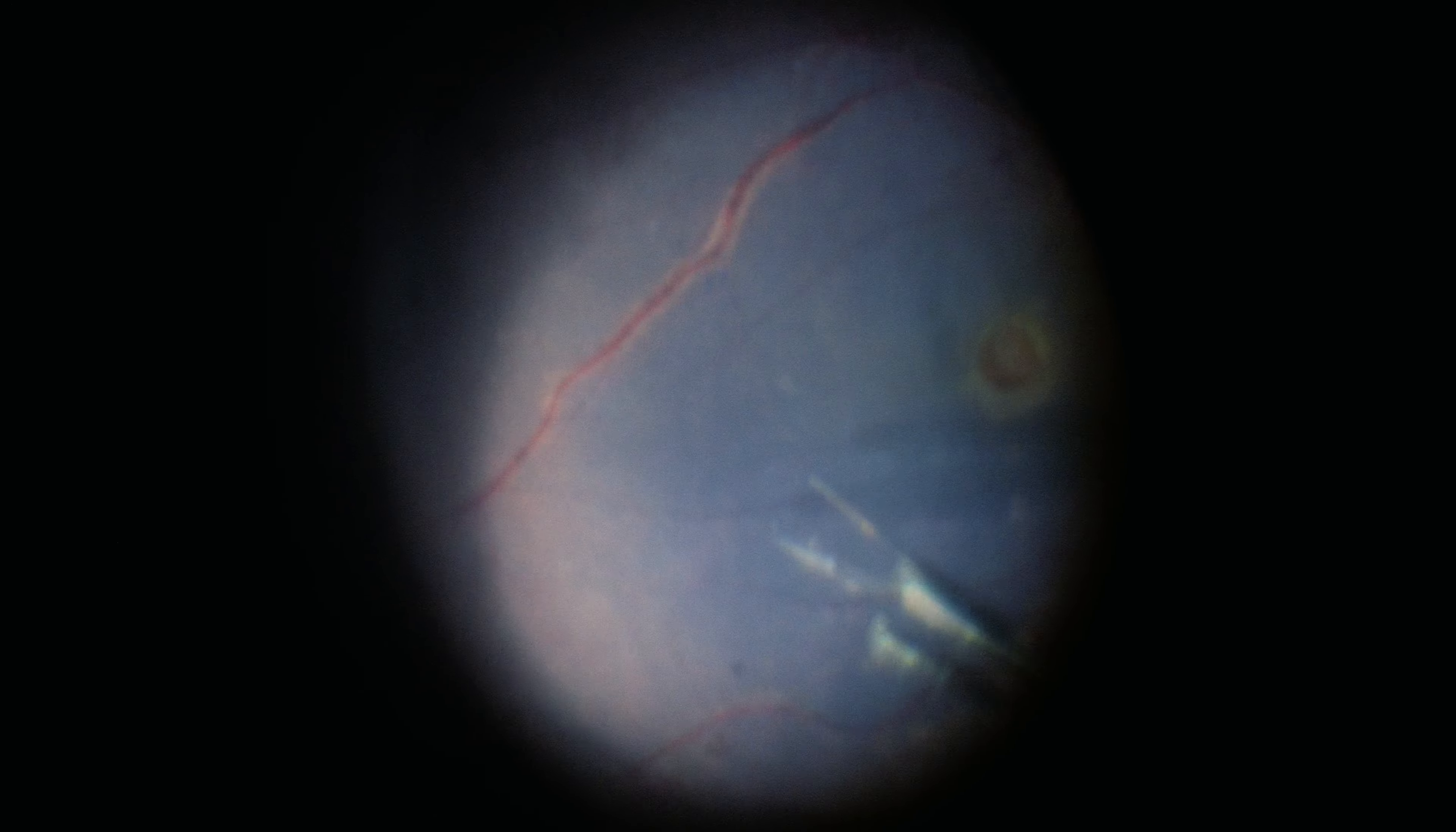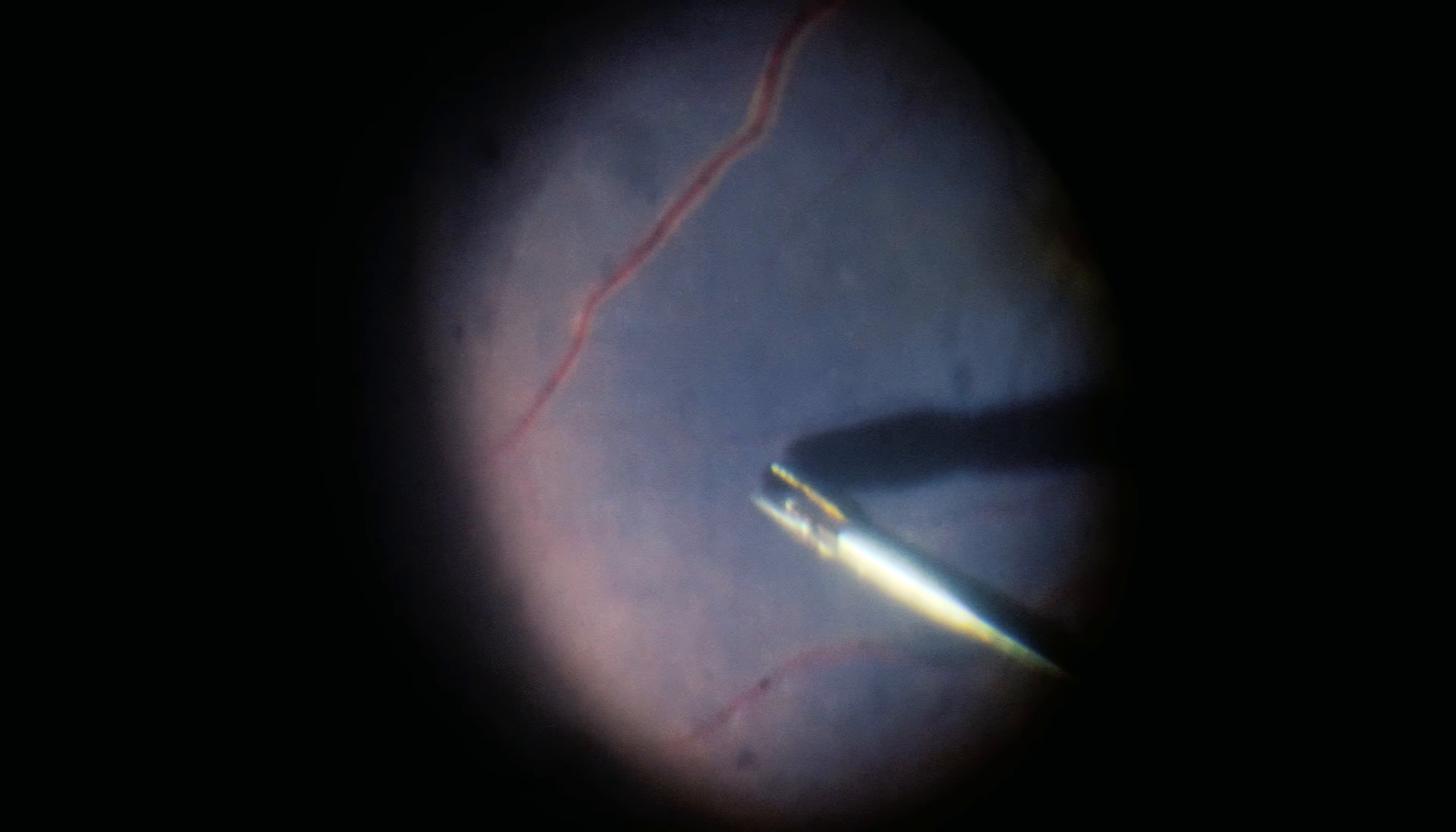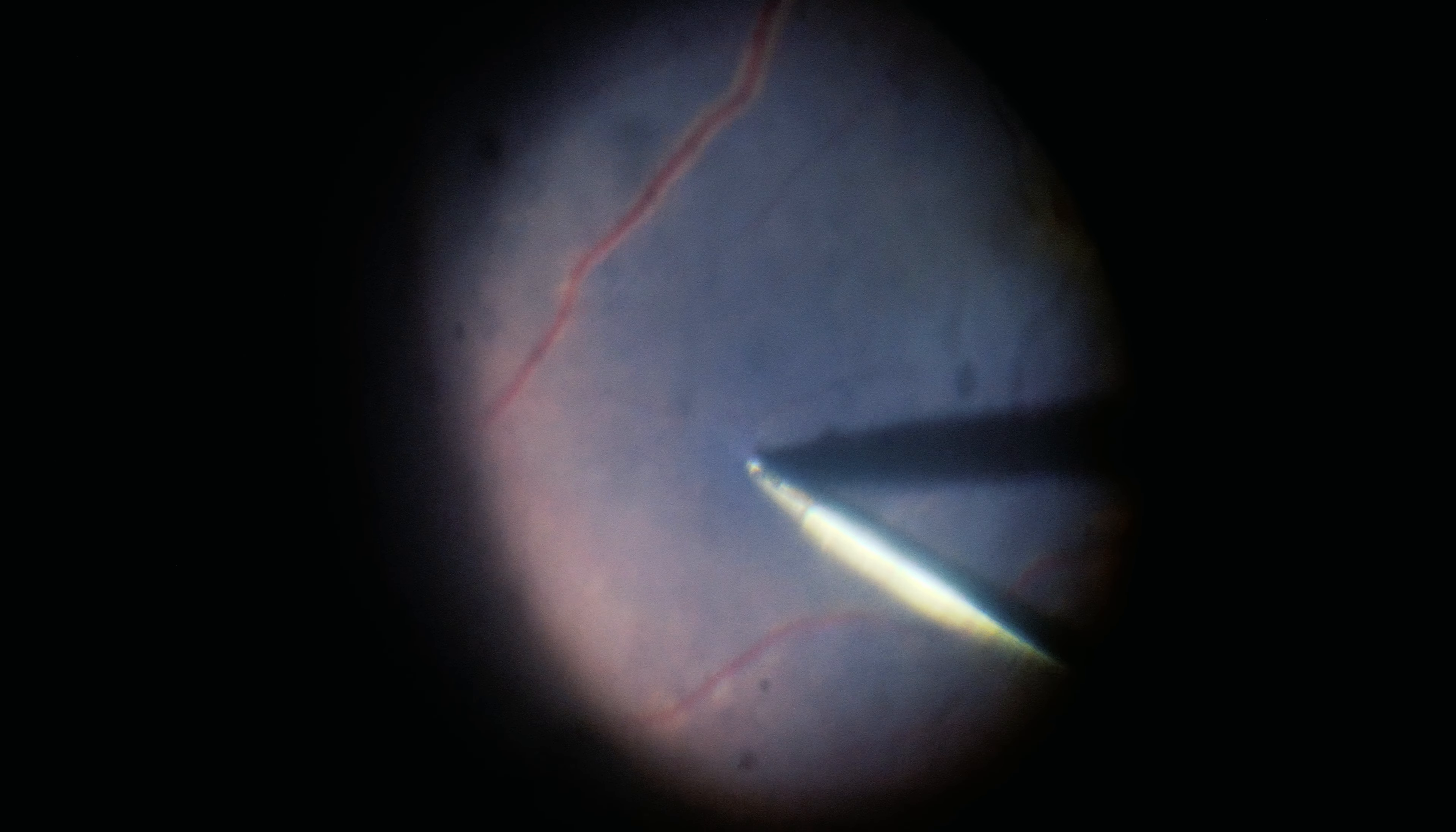A large macular hole could be visualized. The ILM internal limiting membrane was well stained with brilliant blue after a complete air fluid exchange was performed.